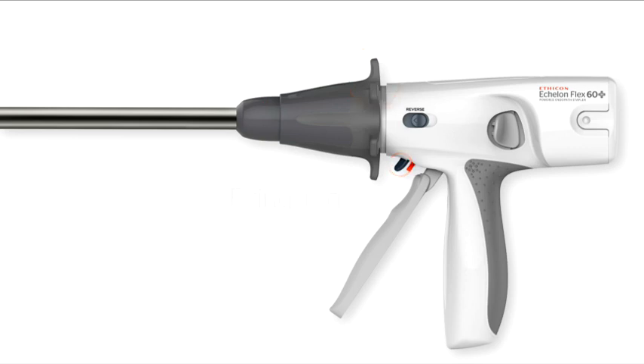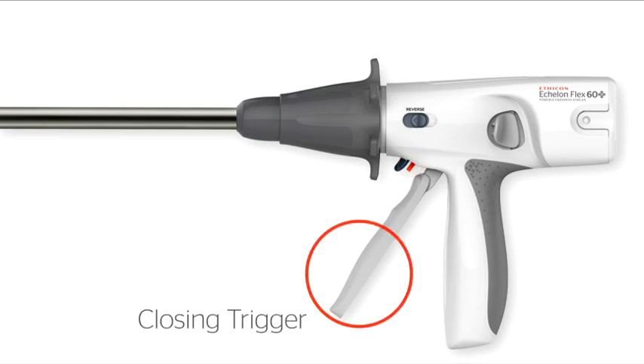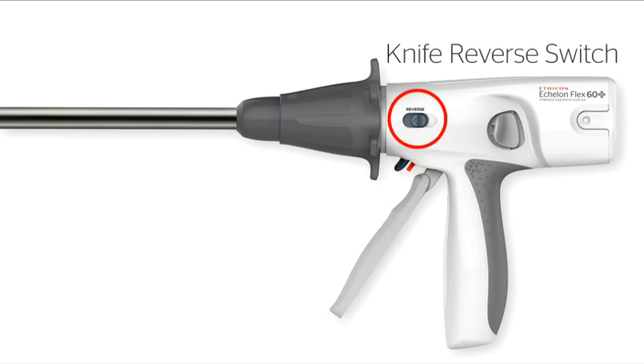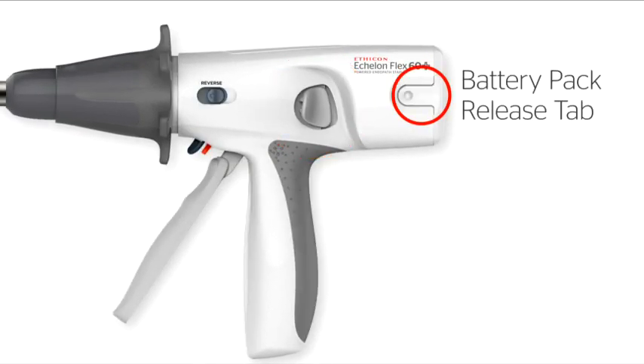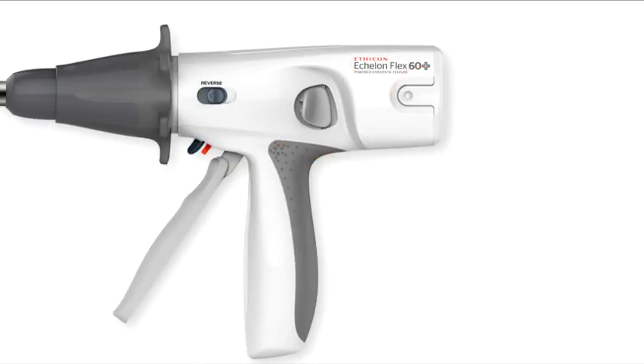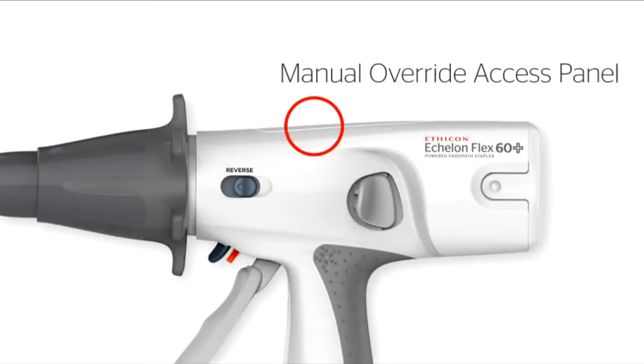Firing Trigger, Red Firing Trigger Lock, Closing Trigger, Knife Reverse Switch, Anvil Release Button, Battery Pack Release Tab, Manual Override Access Panel.